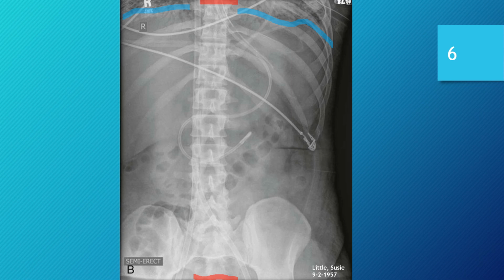Moving on, is the anatomy properly positioned? Well, we'll get our reference lines here. Straight on down, and then about the middle. Yeah, somewhere right around in there. Okay, all right. So from a mid-sagittal standpoint, it's pretty obvious that the patient shifted pretty far to the right in reference to the image receptor, which has given us that very dark area on the left-hand side.